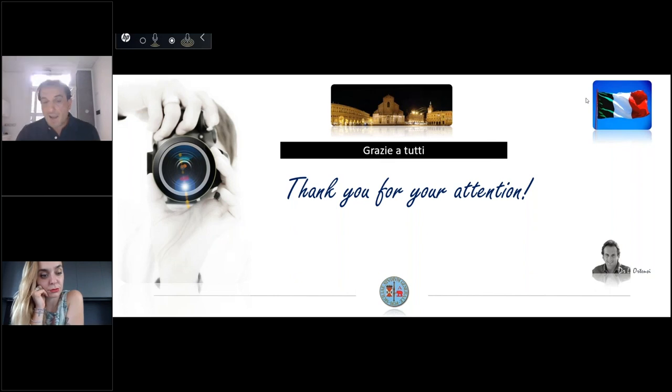After this phase, I take the vertical dimension and I share with my group, my dental technician, all my group, the position of the mandible. Center relation, position of the mandible. Now, if I make some temporaries, I will check the temporaries with Teethan. But I use Teethan at the beginning of my appointment. I don't use Teethan at the end.